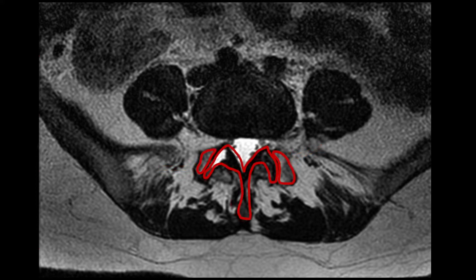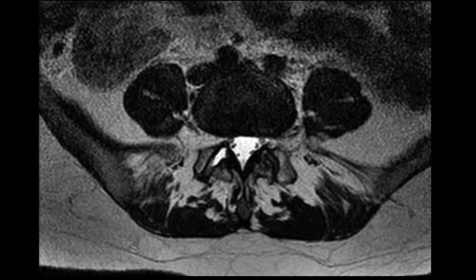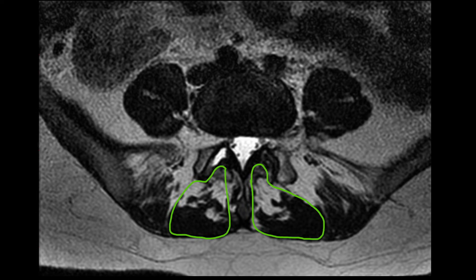The articulation of the facet joints is indicated by the red arrows. Outlined in red in this picture are the two articulating surfaces of the facet joint and the spinous process. Now that we have the other structures identified, it is easy to define the multifidus. The multifidus occupies a space from medial to the tip of the spinous process along the border of subcutaneous fat. The other margin is encompassed by the bone of the spinal process along the lamina and out to the mammillary and articular processes. Often you can see a fascial margin that separates the multifidus and longissimus, though in most degenerated cases this can be more difficult to see.